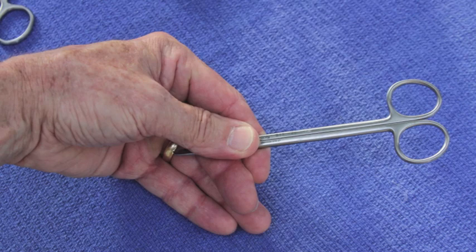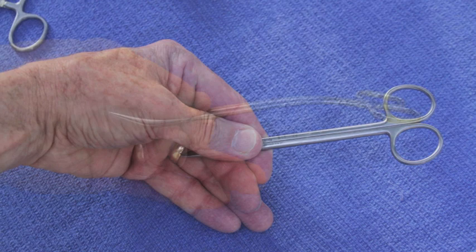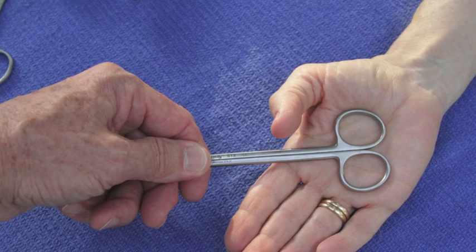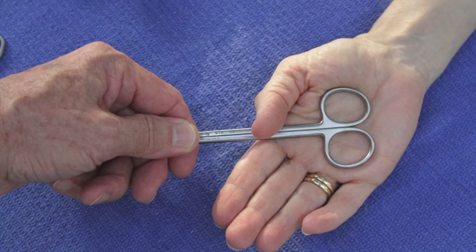In the next series of images, you can see the dental assistant holding the scissors by the beak area and particularly in the region of the hinge. This is to allow the surgeon to be able to grasp the instrument. As the surgeon is ready to receive a pair of scissors, he or she will hold out their hand in such a way that the assistant can place the finger rings onto the palm of the hand.